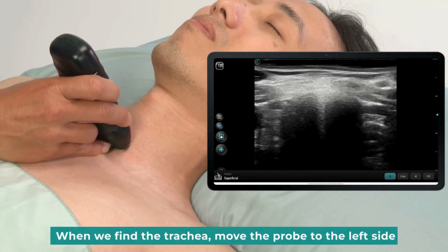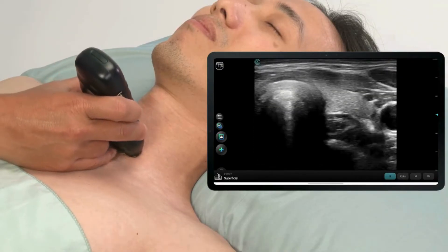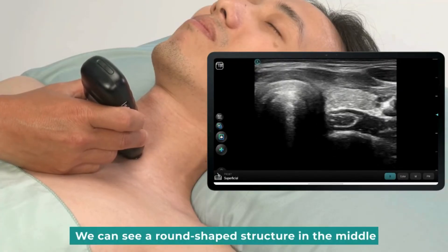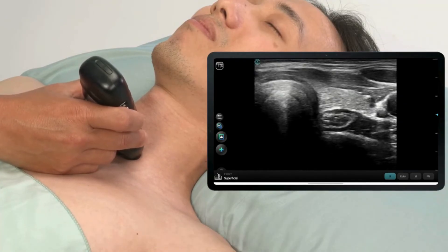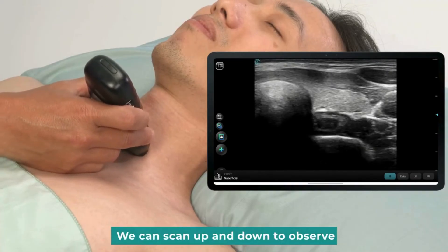When we find the trachea, move the probe to the left side. Sweep up and down slowly to observe its movement. We can see a round-shaped structure in the middle, located in the upper part of the vertebral body. This is the cervical esophagus. We can scan up and down to observe.